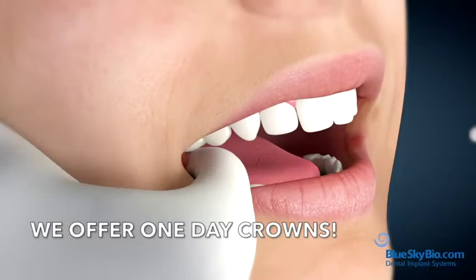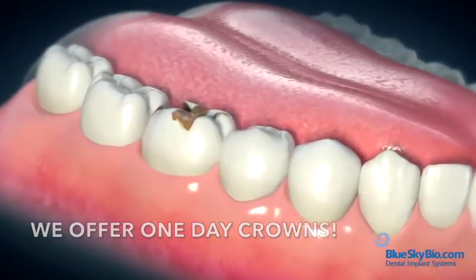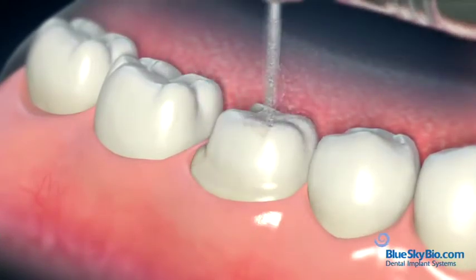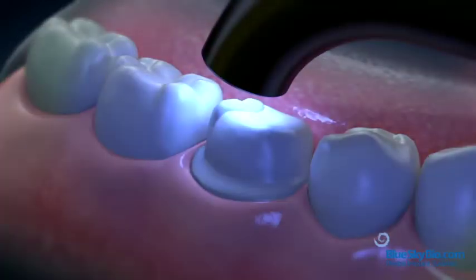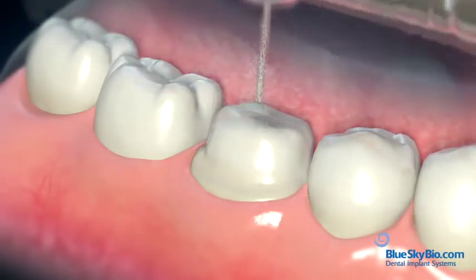For your first visit, the doctor will numb the area around the tooth to help with any discomfort. Then, your dentist will use a dental instrument to form and prep the tooth so the crown will fit properly. Sometimes an additional procedure may need to be completed to ensure a good fit for the crown. This procedure is generally what's called a build-up. Its job is to help support the crown.